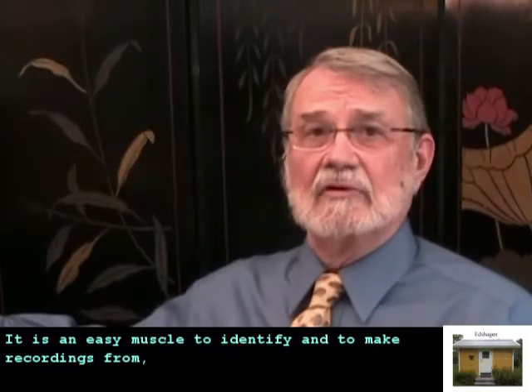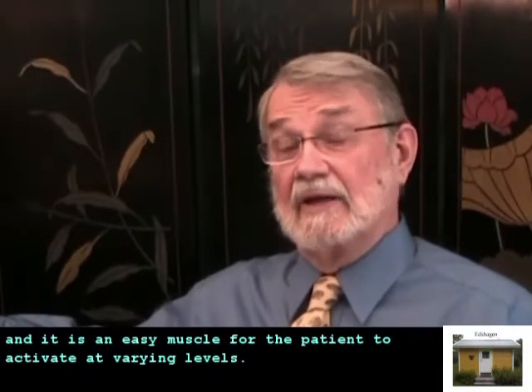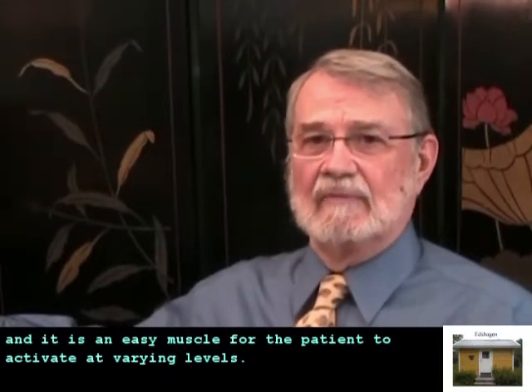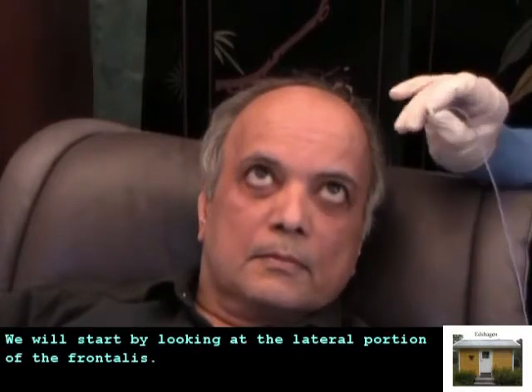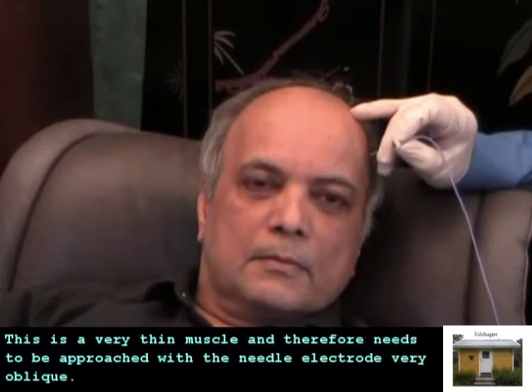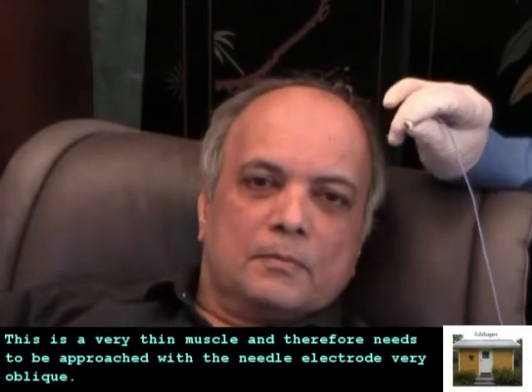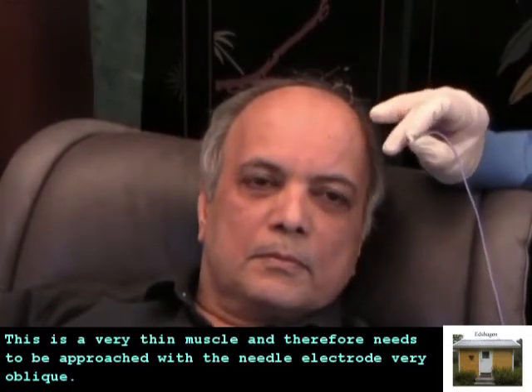It's an easy muscle to identify and to make recordings from, and it's an easy muscle for the patient to activate at varying levels. All the patient needs to do is to open the eyes and look up to a varying degree. We'll start by looking at the lateral portion of the frontalis. This is a very thin muscle and therefore needs to be approached with the needle electrode very oblique.